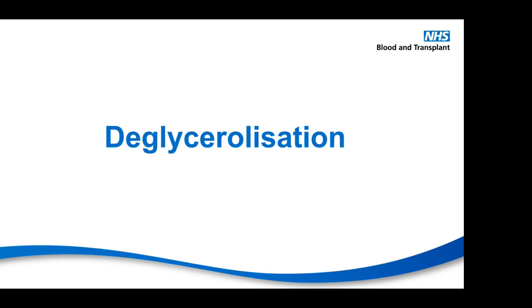We have 2 ACP machines which carry out this process. It takes about 4 hours for the whole process from start to finish, so you can do 2 units within 4 hours at NHSBT.